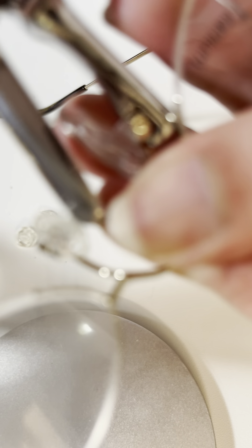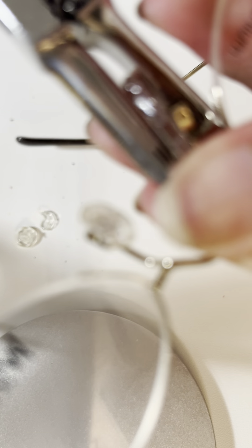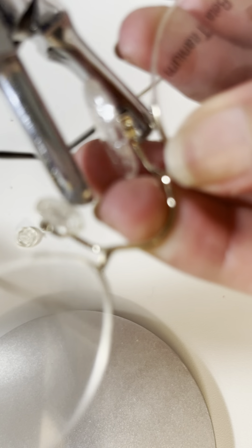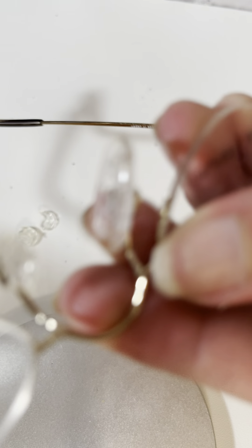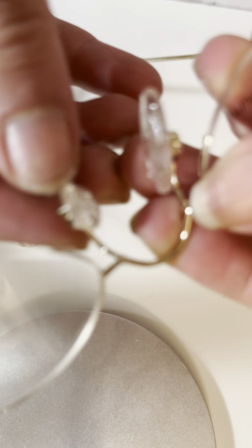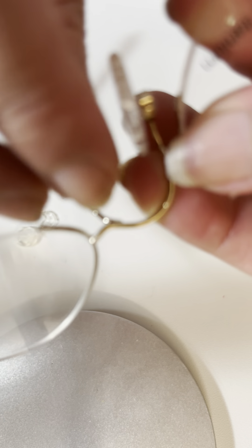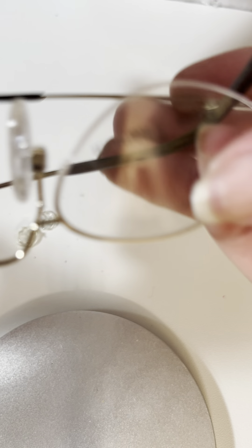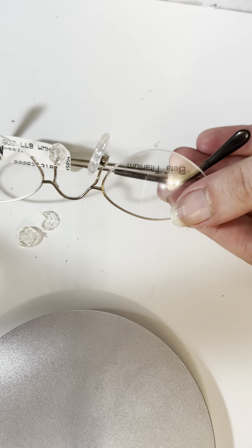On this part, we're going to hold on to this part and push in with this. And there it is — you have it in. These are pop-on nose pads. This one had a bit of a technical difficulty — you can see it broke, but these are what pop-in nose pads look like. Thank you.